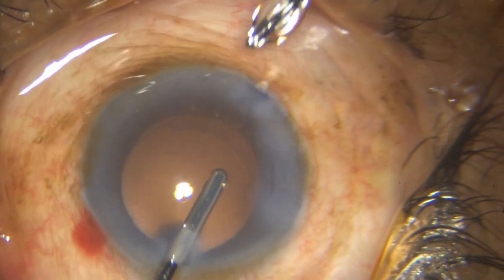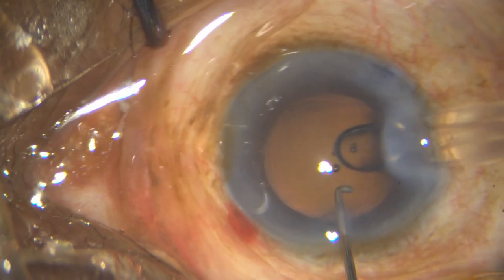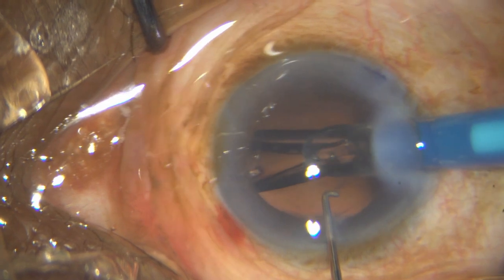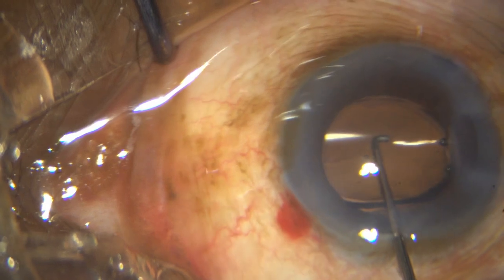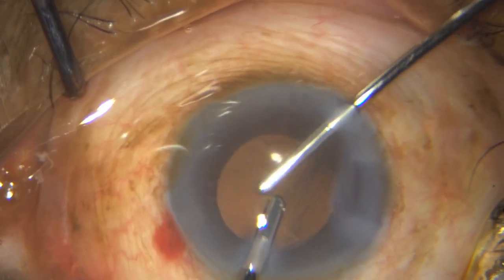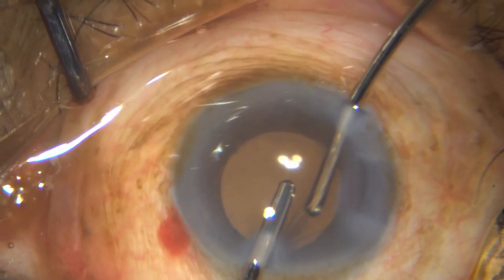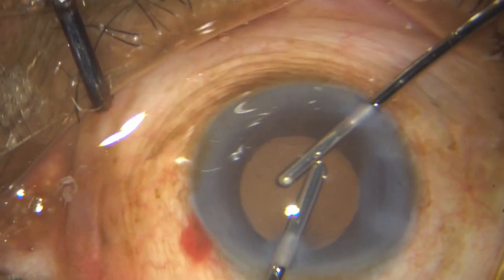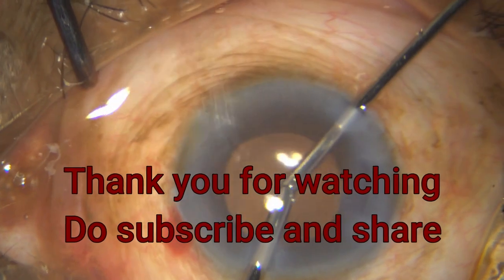Under viscoelastic, I then put in my single-piece hydrophobic IOL directly into the bag, just helping it with the Sinskey hook as well. All has gone well — you can see the wound is pretty clear, there is no wound burn, there is no corneal edema, the cornea looks quite clear. So all in all, I am hoping for a good post-op result. Thank you so much for watching.